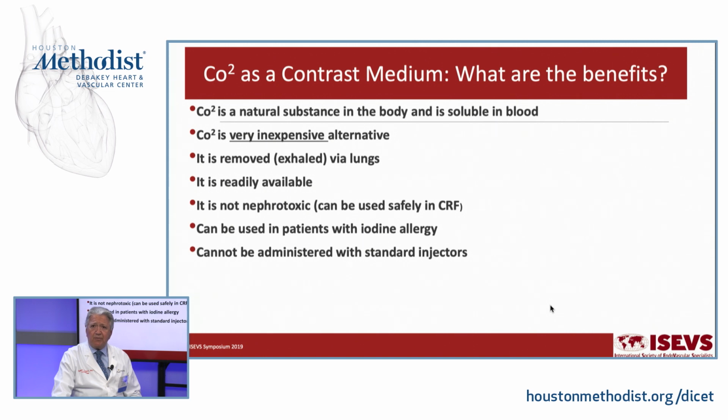However, this particular substance cannot be administered with the standard, so-called power injectors, but has to be administered with hand injectors, and therefore the resolution as far as imaging is concerned might not be as good as with iodinated contrast. It can cause a certain amount of pain, particularly in the abdominal circulation, but also in the lower extremity circulation.